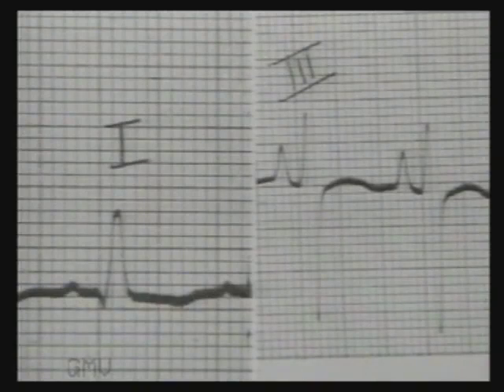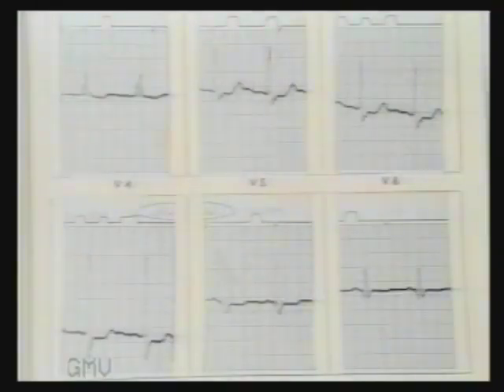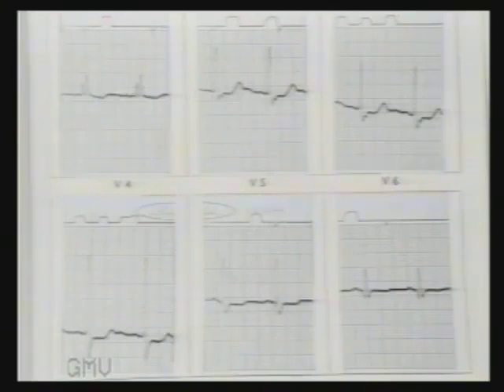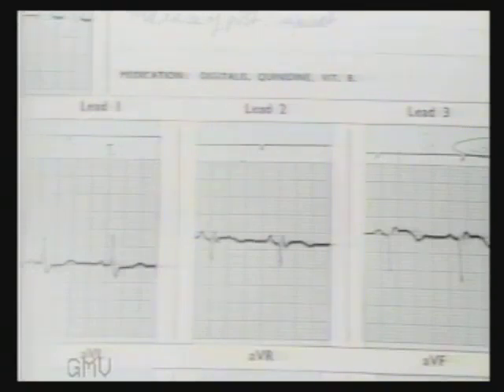The QRS is slightly widened but not to three small squares. Sometimes right bundle branch block may be associated with left anterior hemiblock because both bundles have common blood supply. This ECG shows an RSR' pattern in V1 and broad shallow S-wave in V5 and V6 — so this is right bundle branch block. But in limb leads there is left-axis deviation. So this is right bundle branch block with left anterior hemiblock.